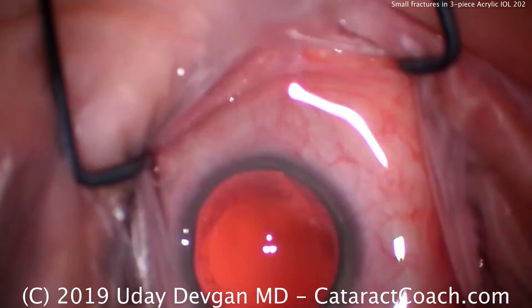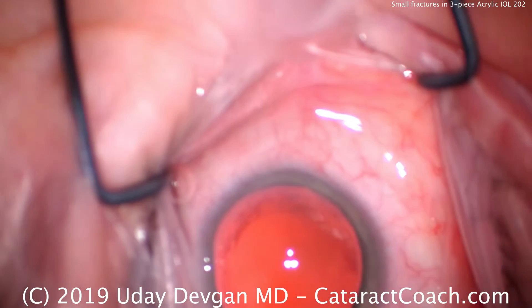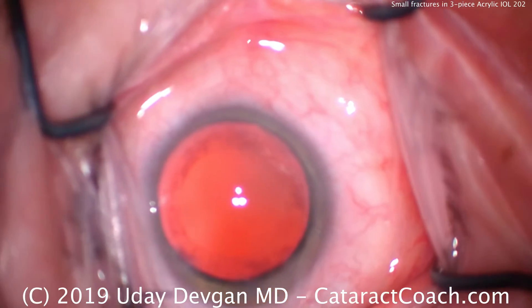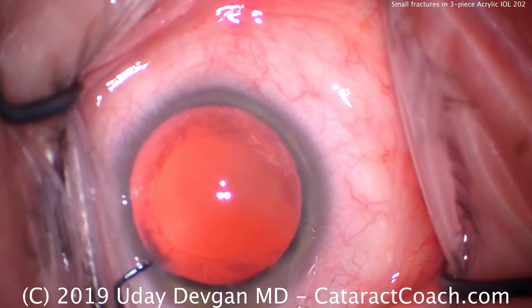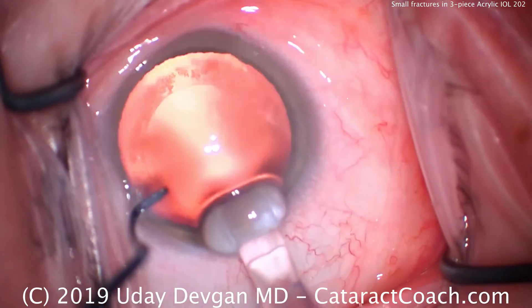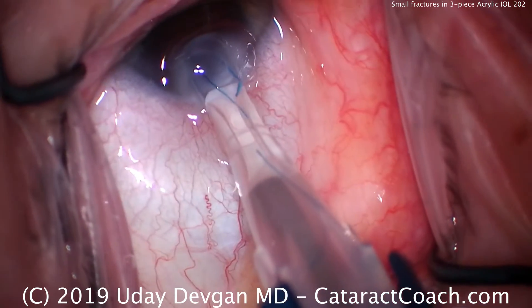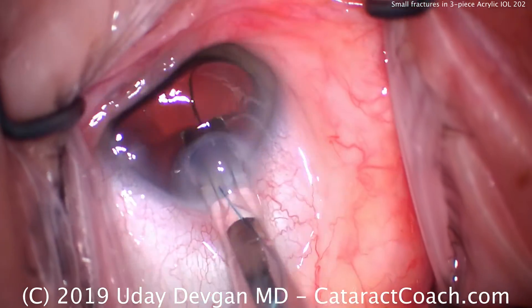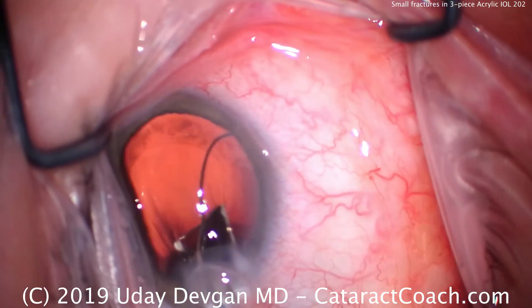Zooming in on the eye here, the capsular bag has already been inflated with cohesive viscoelastic, and here comes the lens. We're going to fixate the eye with the chopper initially, just to get the injector tip there to the incision and start delivering the lens. This is a wound assist technique — this is why the eye is moving nasally.